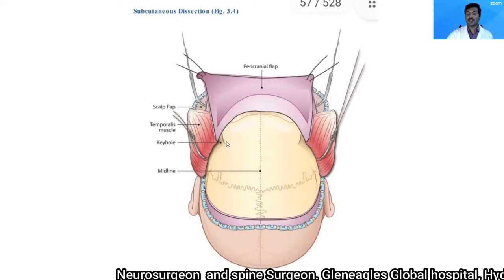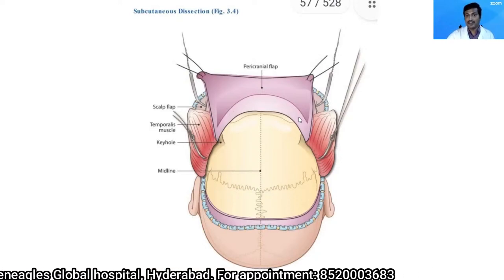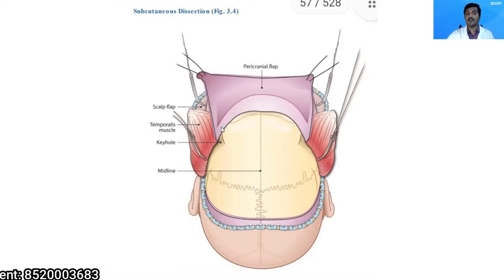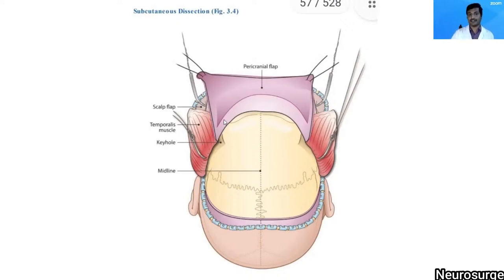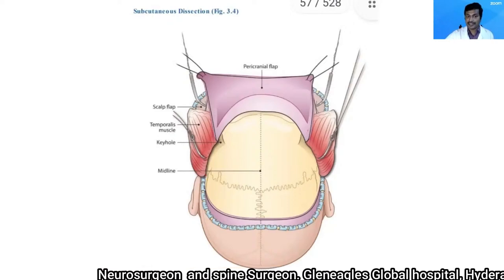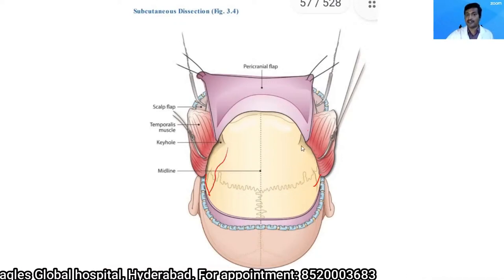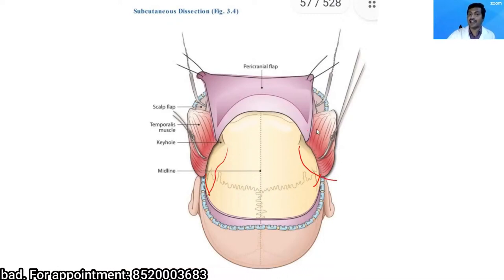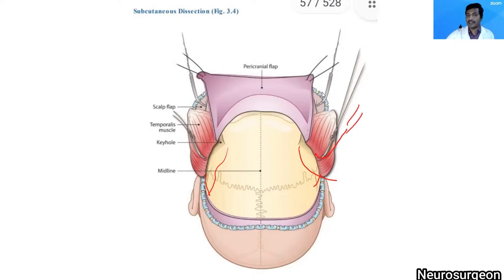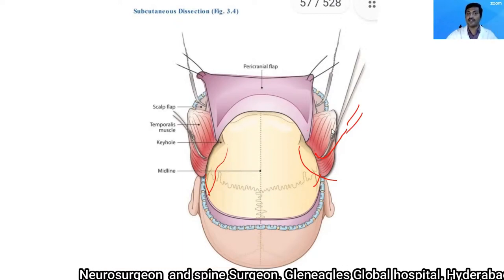I use a combination of periosteal elevators and blunt dissectors to elevate the pericranial flap. Every effort should be made to keep the pericranial flap intact without any holes. If there is a small hole, I suture it back. I cut the temporalis muscle at the posterior extent of the incision, detach it from the superior temporal line on either side, and reflect it anteriorly held with fish-hooks. Whenever I reflect a flap — skin, pericranial, or temporalis — I use gauze rolls so the reflection does not kink the blood supply.